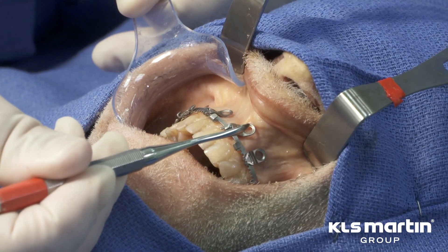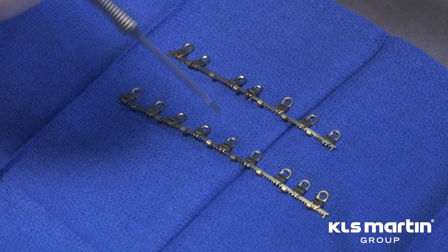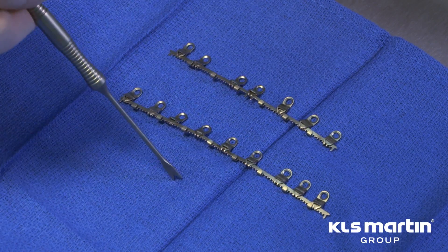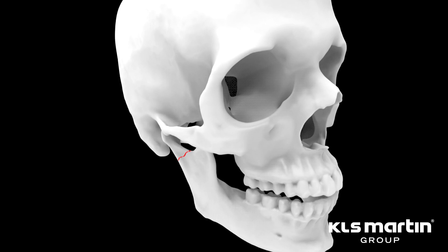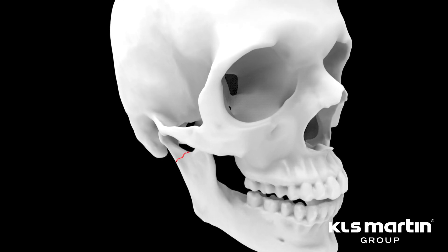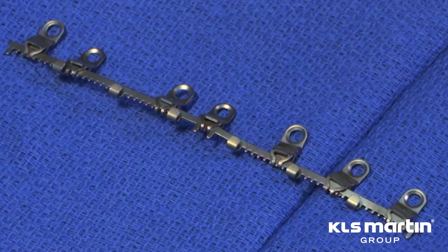After approximating the bone fracture, measurement of the arch, and identification of the midline, select either a seven hole or nine hole arch plate. In situations where the fracture does not interrupt the arch, such as with subcondylar fractures or LeFort 1 fractures, the seven hole design is ideal. It features a fixed midline and spans 110 millimeters.